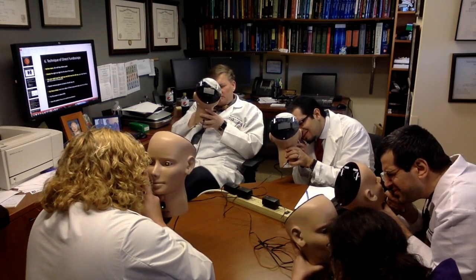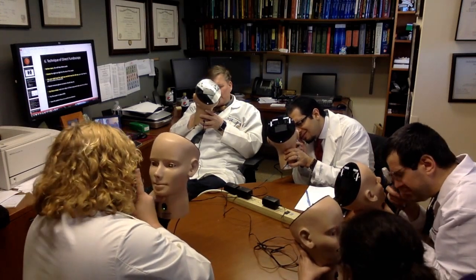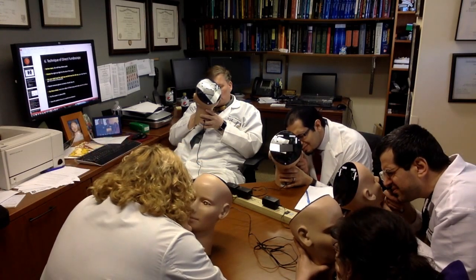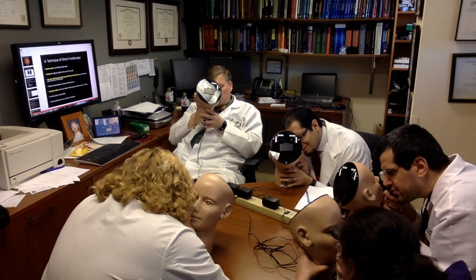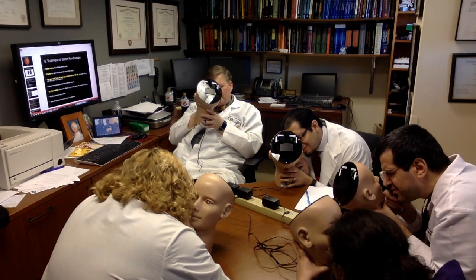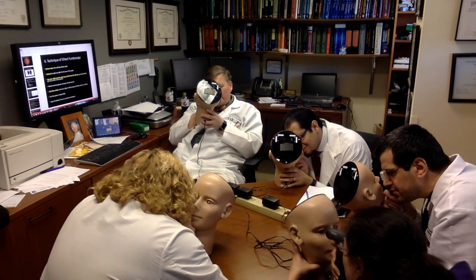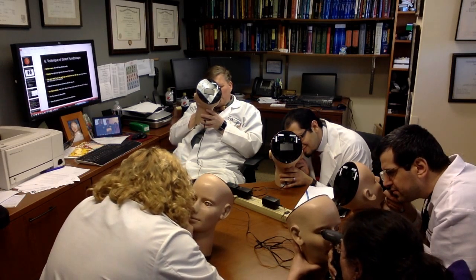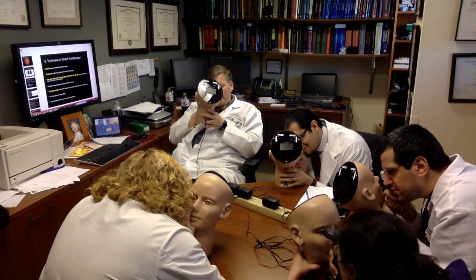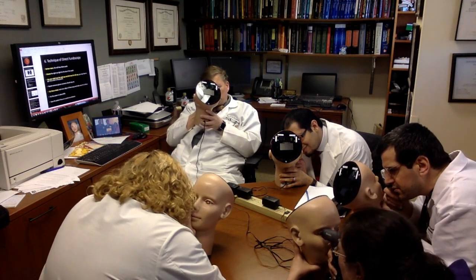Then in the disc, if you look in the direct center of the disc, you'll notice it's whiter in the direct center, right? That's the physiologic cup. You see the cup? Okay, good. That's where the blood vessels come out. You're going to make a determination of approximately how big the cup is compared to the whole disc. A normal person is about a third the size, maybe up to half the size.